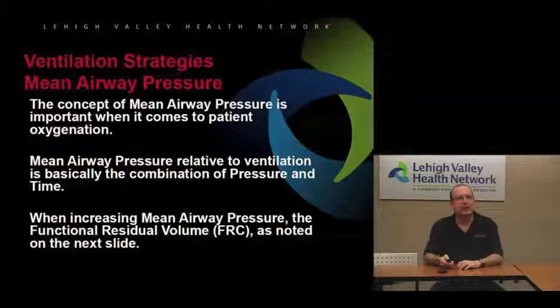So when we think of mean airway pressure, I personally think of oxygenation. Ever since it was explained to me this way some years ago, I've had a much better understanding of how to oxygenate patients that we're having difficulty with. Basically, mean airway pressure is just a combination of pressure and time on your ventilator. So it has to do with your PEEP, which is there all the time. So it's there 100% of your time. If you have 5 of PEEP on, that pressure of 5 is there all the time.